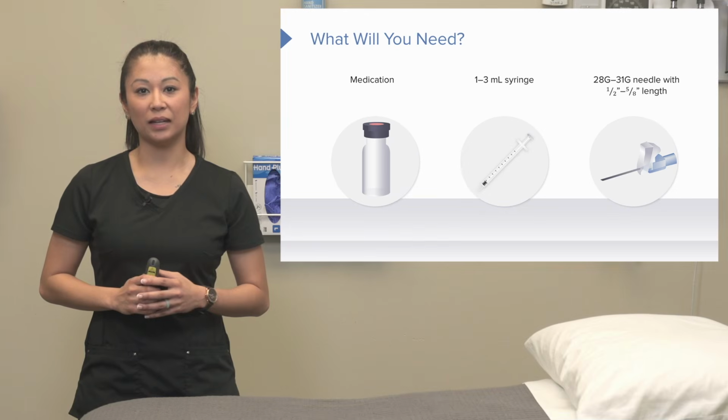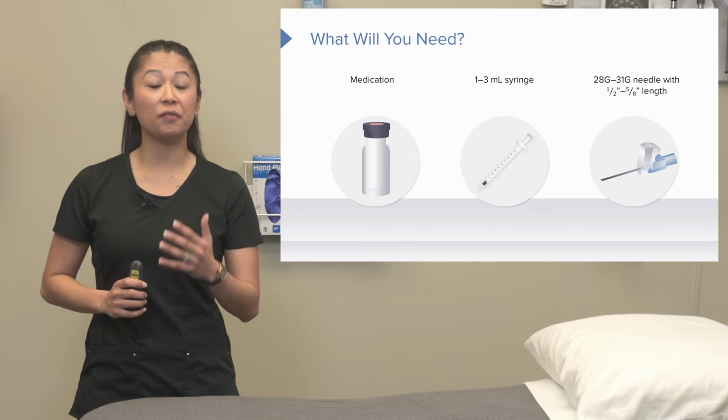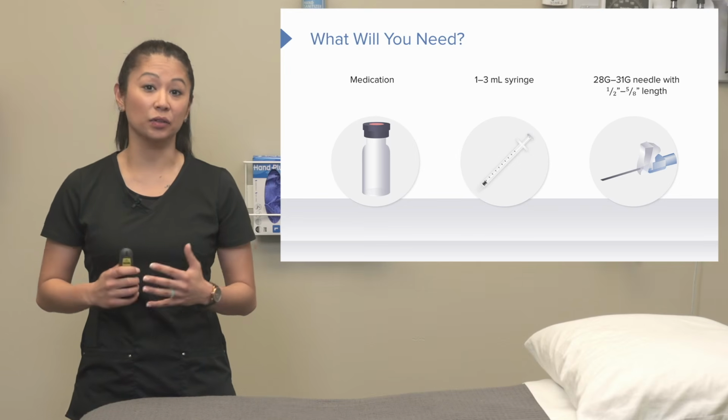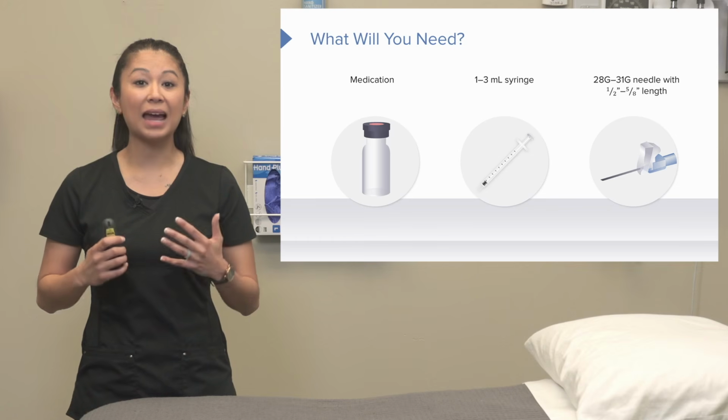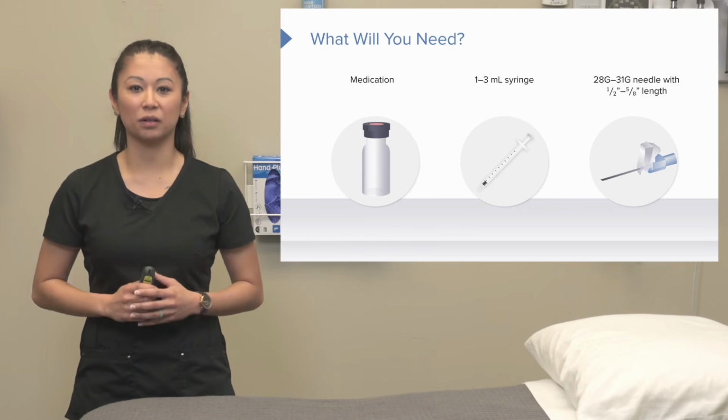Take a look at the length here. This one's pretty short. A half inch is pretty long, but 5/8 is also very common in needle length. We're only going into the adipose tissue, the subcutaneous tissue, so the needle can be much shorter.